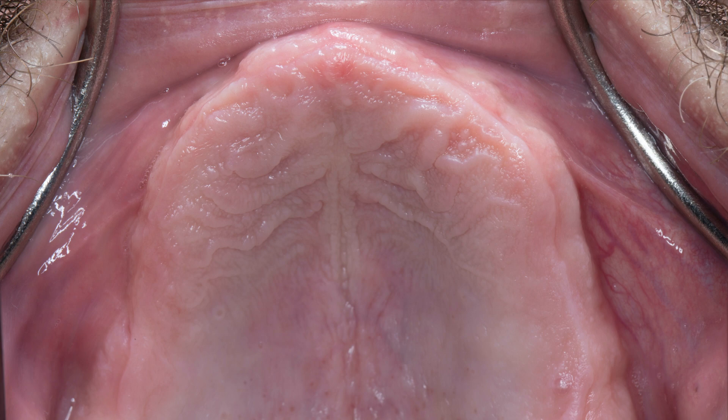In this case, we will elaborate on the treatment of the maxillary arch utilizing a multi-level surgical guide protocol, from the treatment plan to the delivery of the provisional screw-retained implant prosthesis.